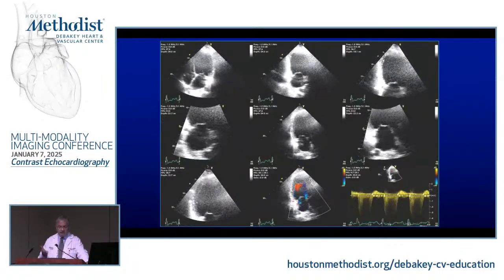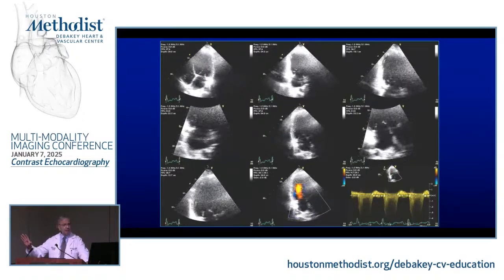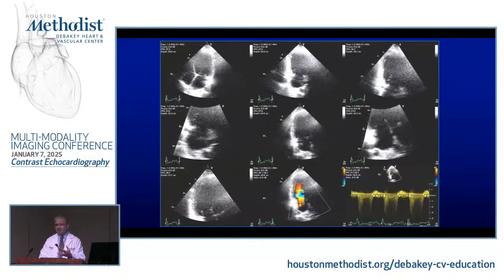Now, this is another case where it's not a difficult one to say ventricular function is depressed. And you could venture even to say that the ventricular function is severely depressed because there is no descent of the base, and I have an inferior wall that's completely akinetic, the lateral wall is akinetic, I don't see the apex well, I don't see the anterior wall well, but I won't be too far from knowing that this individual is in trouble one way or another, right? But remember, whenever you see a ventricle like this, it is a harbinger for other issues, other problems.